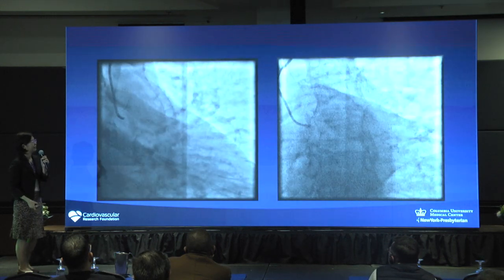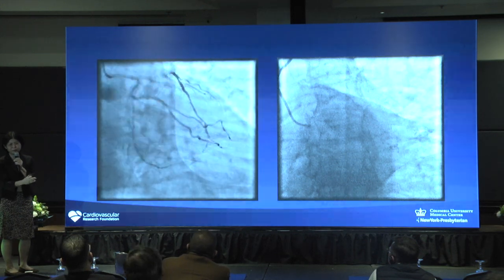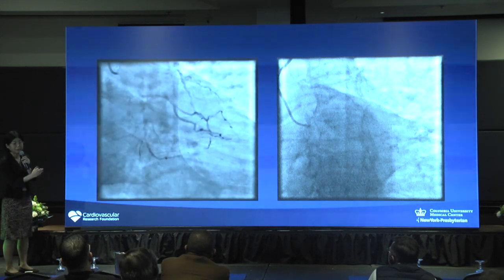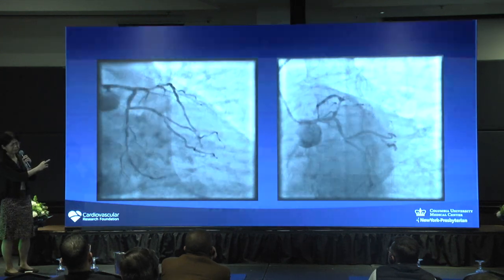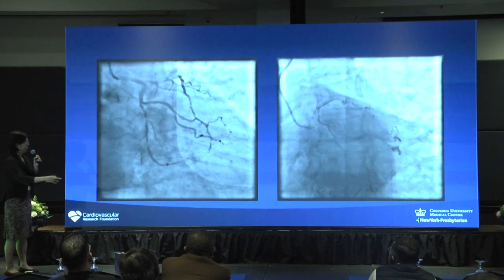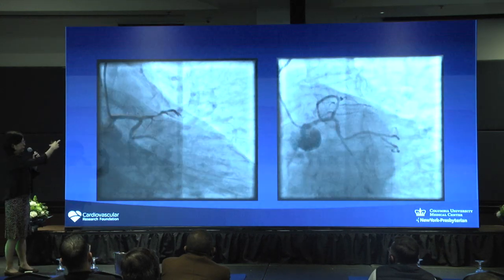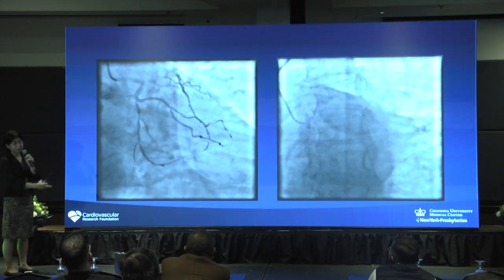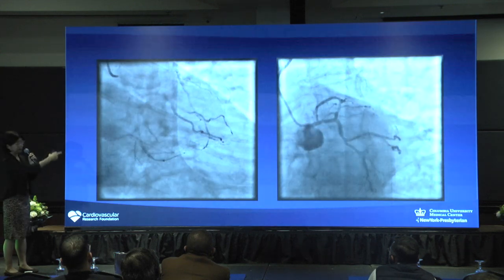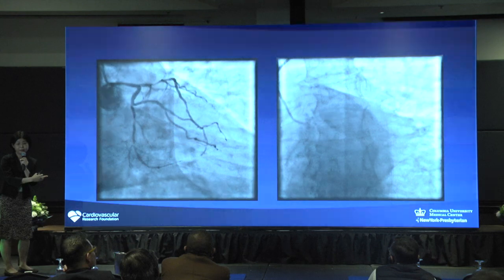Next. You see that this case was relatively long compared to the other case, a long left main, I meant. But importantly, like diffuse disease, the left main caliber doesn't change too much from proximal to mid to distal, and the distal left main size is almost similar to the circumflex. Do you think that left main is stenotic, significant?